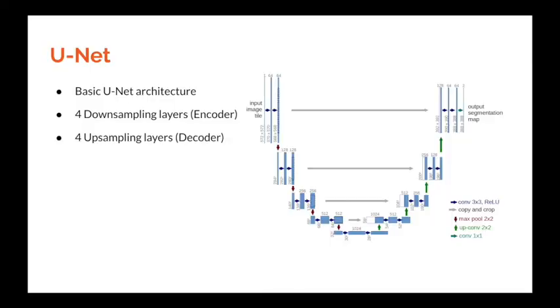This is Wendeng. Thanks, Todd, for the detailed explanation of our project's background and how we pre-processed the data. So as you know, the model that we selected is a basic UNet. The reason why we chose UNet is that our goal is to provide a predicted mBravo GAD with the same spatial dimensions as our input image, and UNet can handle this problem well.